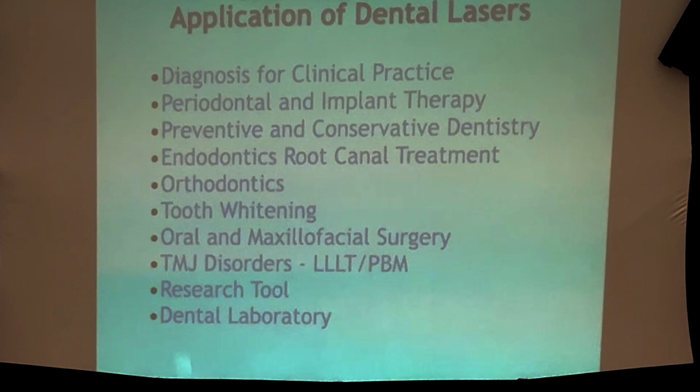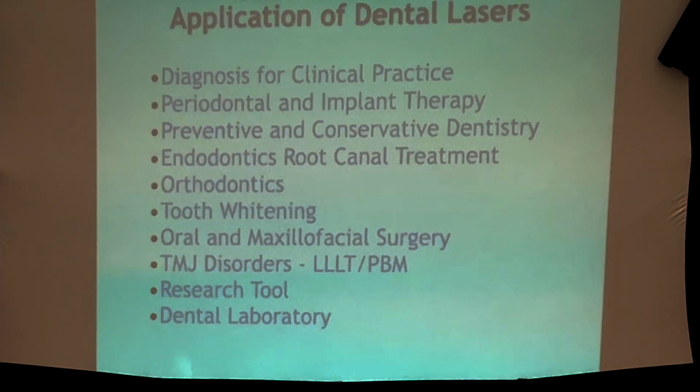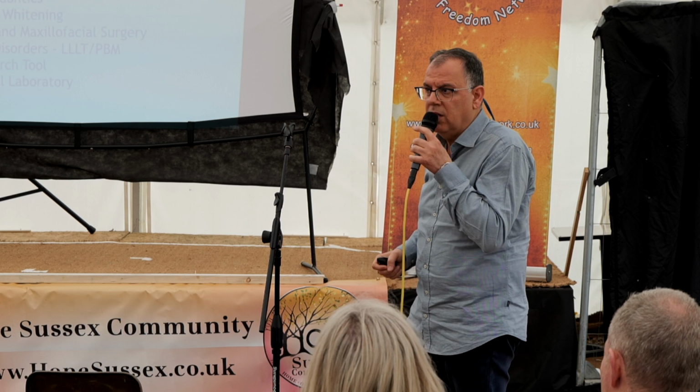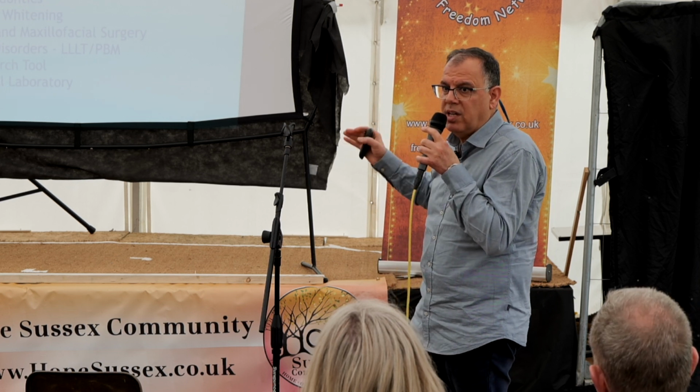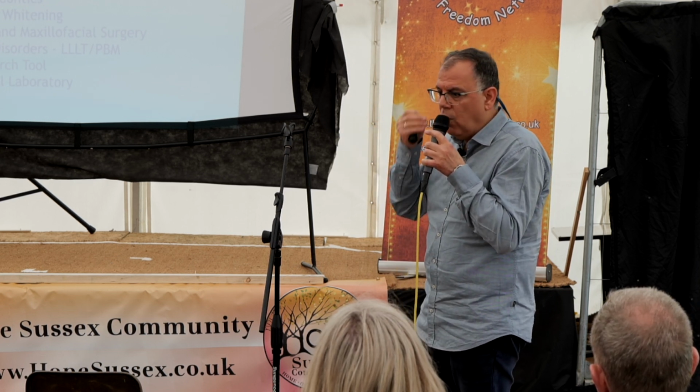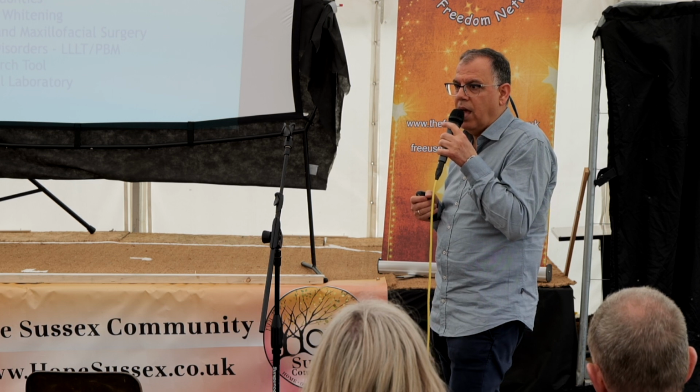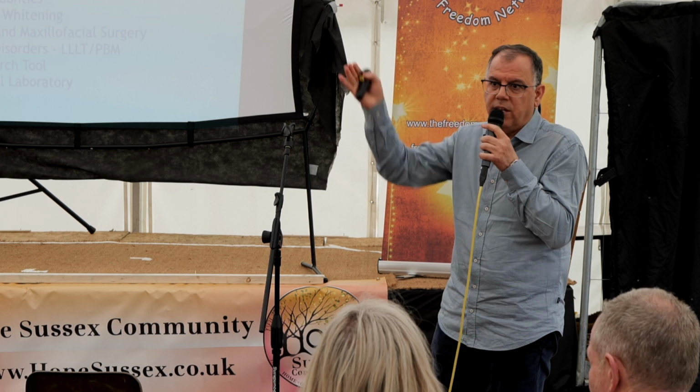Orthodontics, it's the removal of the braces with the hard tissue laser, or in maxillofacial surgery, removing a cyst, sterilizing the cyst. I will show you some cases later on that I did many years ago with a high success rate, removing a whole cyst in the mouth about the size of a hazelnut or walnut, with only the application of laser, without doing any surgery, without doing any flaps.